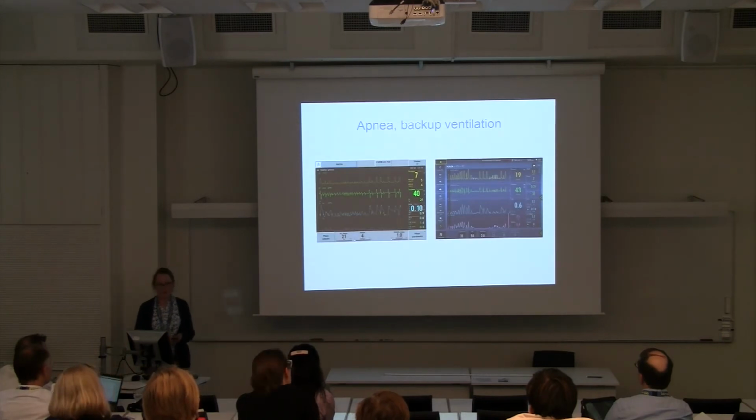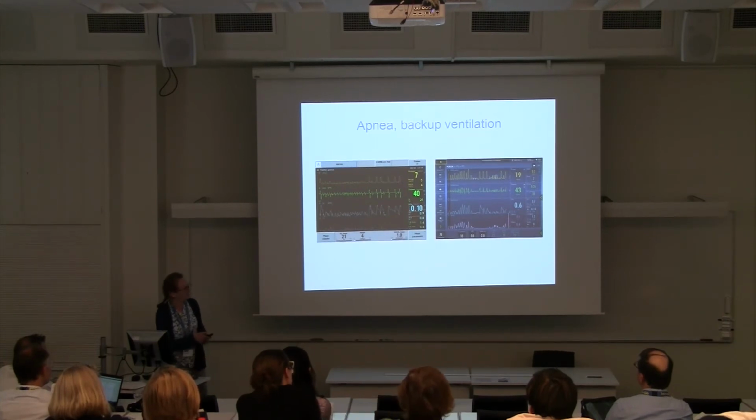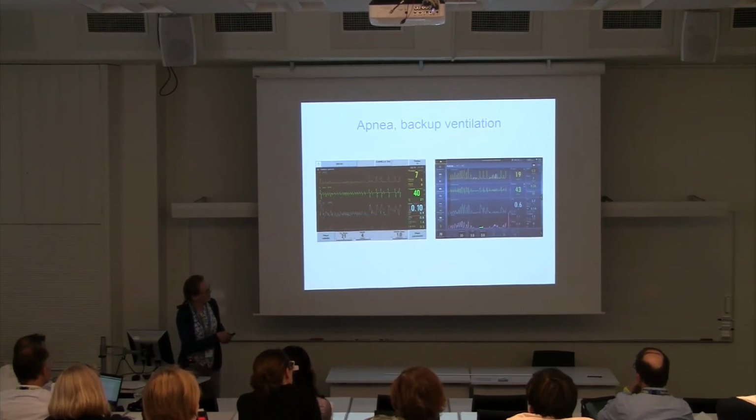And here both infants have apnea. You can see the flat EDI signal, and that's when the backup ventilation takes place. Here are longer apnea and some backup ventilation.